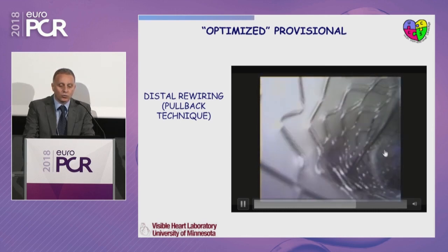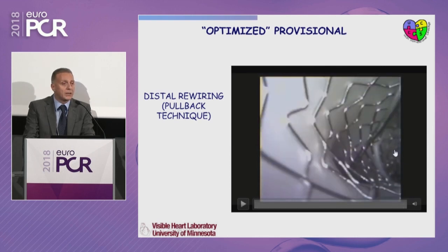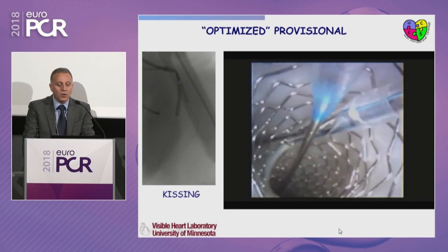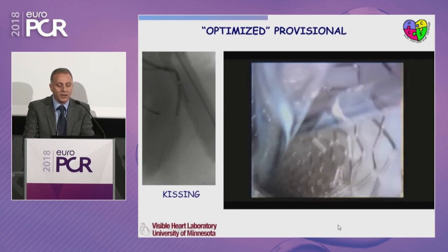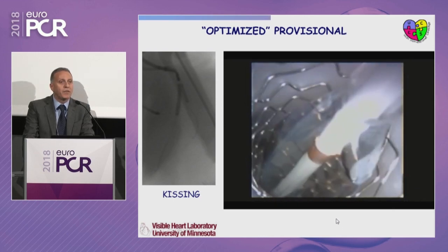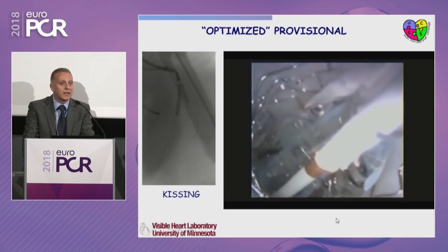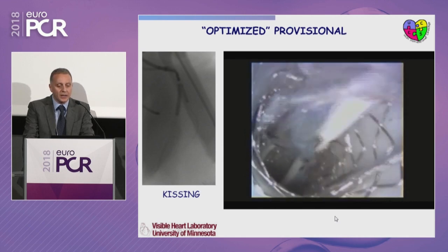To do this, you should go distally with your guide wire, which should be appropriately bent to scrub, and then as soon as you have the carina, you will enter really into the distality of the side branch ostium. And this will allow you, when you are going to perform the kissing balloon inflation phase, to have the best benefit of kissing balloon. I mean, if we do not reach this distality, we will not even remove the stent struts from that area.